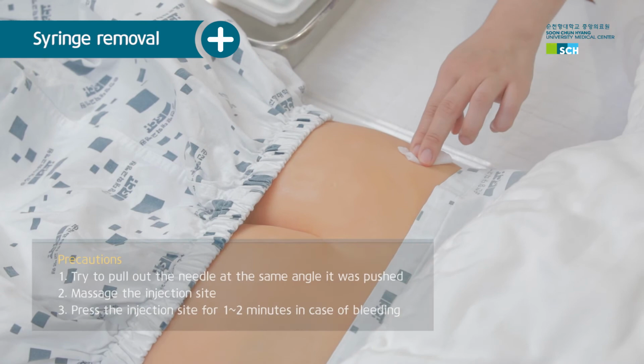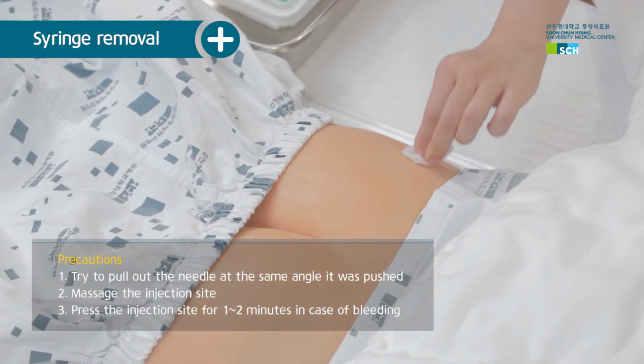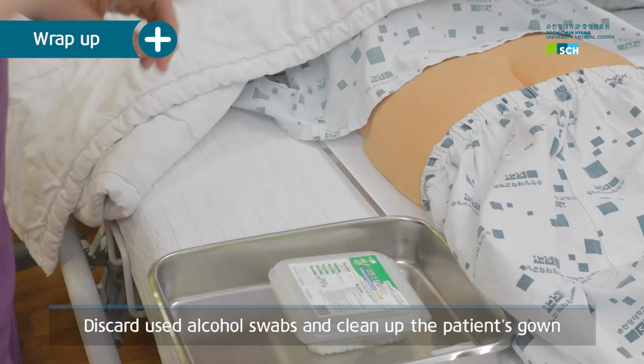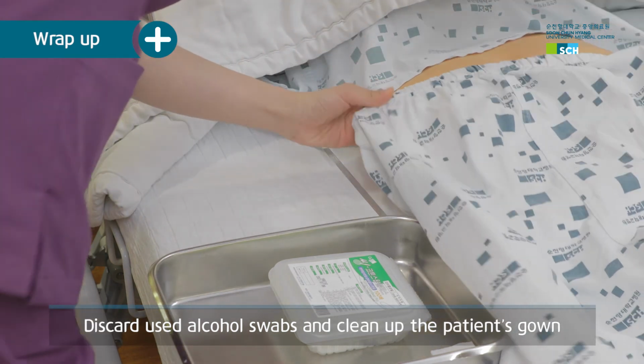When the injection is finished, apply alcohol swabs to the injection site. Remove the needle in the same direction as it was pushed and massage the injection site gently. Place the used alcohol swabs on the nursing tray and dress the patient with a hospital gown.